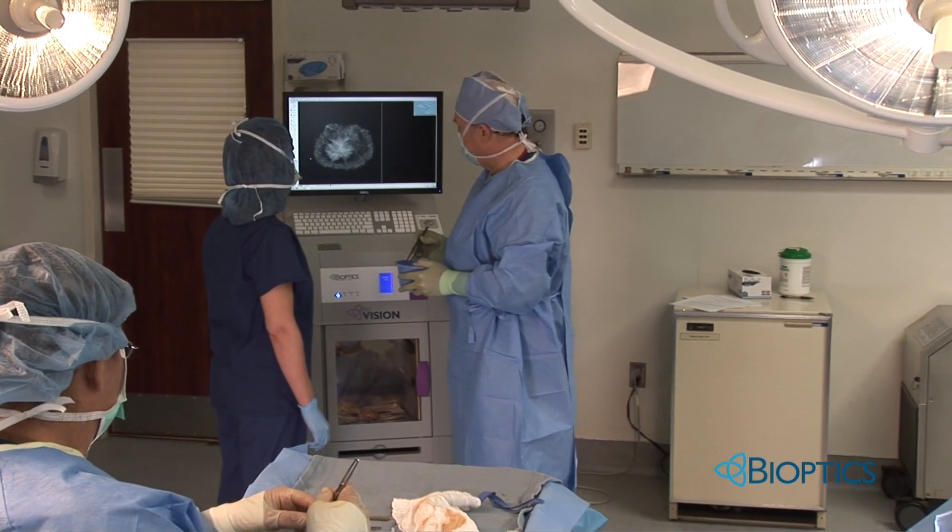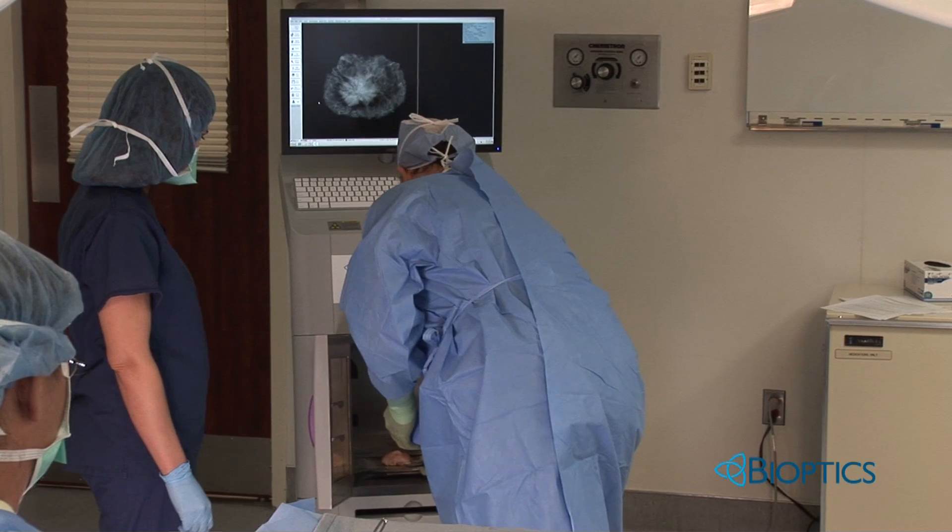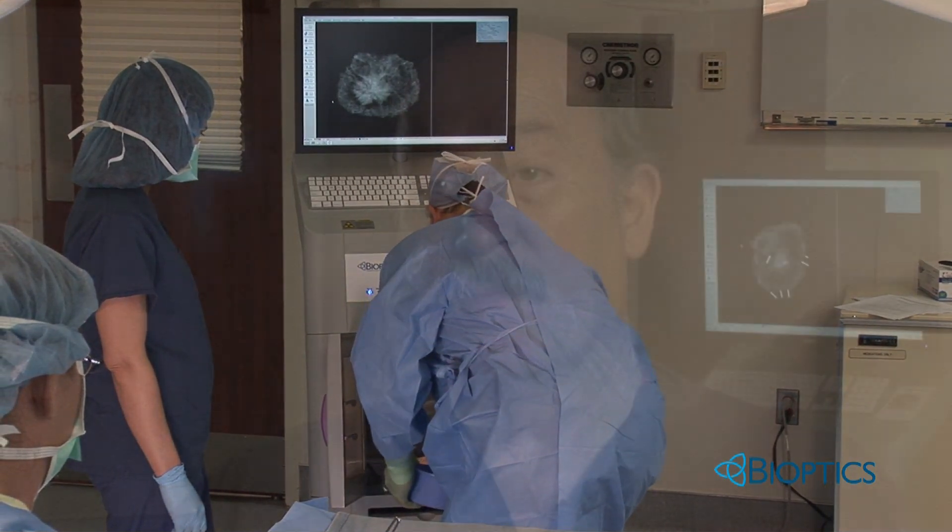The image is enhanced automatically, making additional operator manipulations unnecessary. We put the image on the screen and it has been corrected — it's optimized. The algorithm will work out all these details, not requiring that I manipulate any dials, monitors, etc. So I'm very happy with the automatic mode on the image that we get.